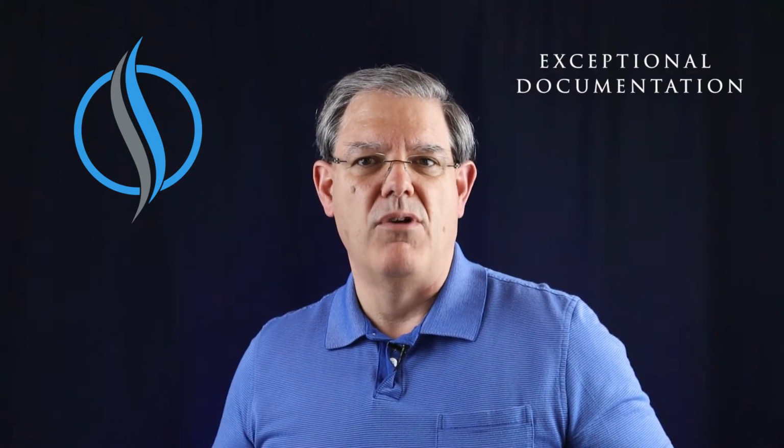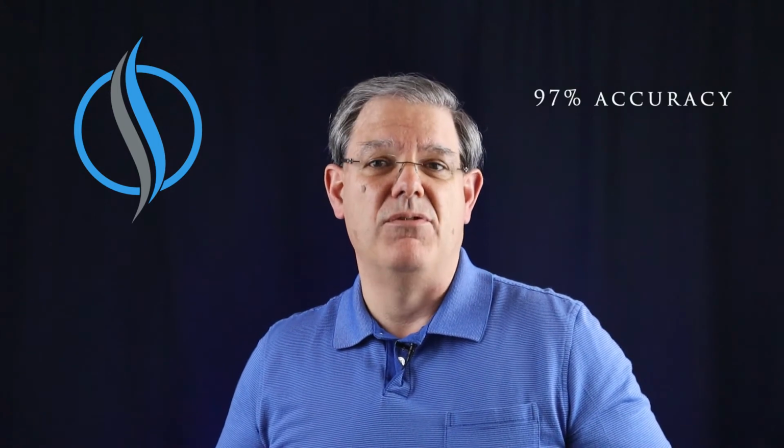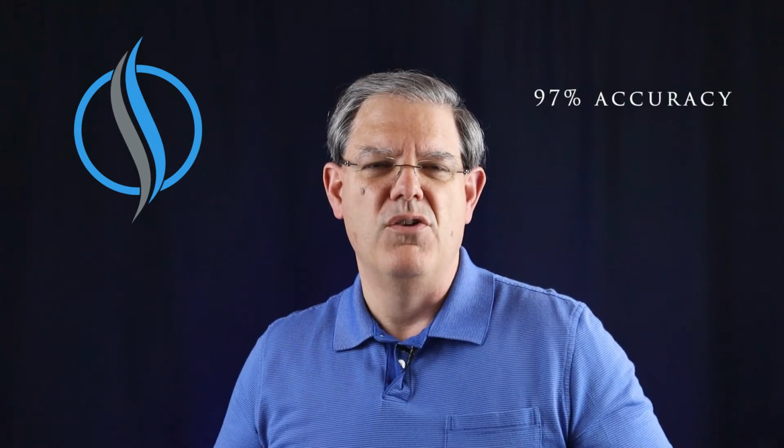The second reason is it is exceptional for documenting progress, particularly where insurance is involved. Thirdly, it keeps my skills sharp. A study was done where doctors were trained using visual feedback on the computer over a several-month period of time. They were then tested monthly and found to be 80% accurate without feedback. While this is good, we know from other research that doctors are 97% accurate in applying the correct forces when using the computer. You can appreciate how this data greatly helps us deliver treatment to the best of our ability.